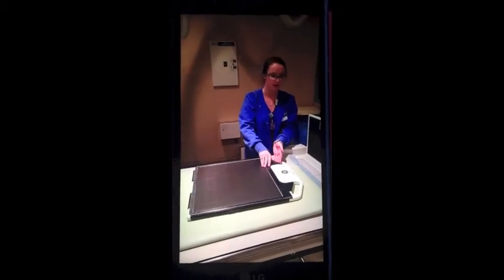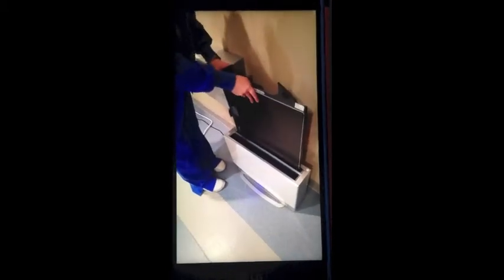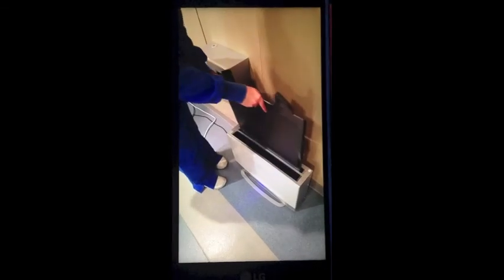You go to take the grid back off when you want to go back to charge it. You're just going to pop it back off and it comes off very easily, so you want to make sure that you're careful with it. And then you're going to place it back into the second holder, not the first one, so that's where your grid's going to go. And you want to make sure you turn it face out so it'll go in there.